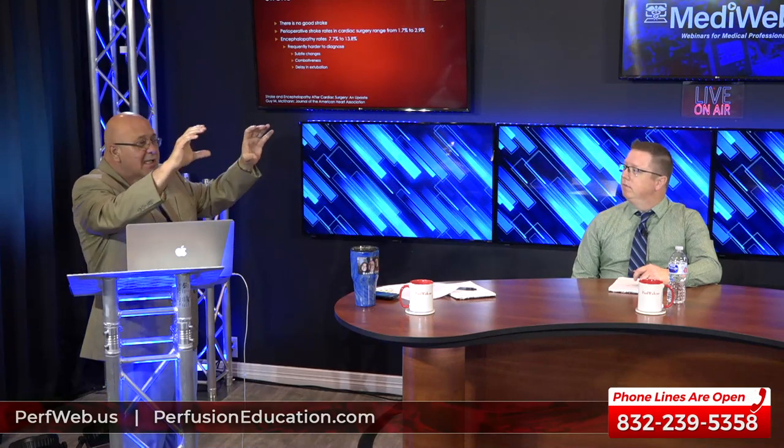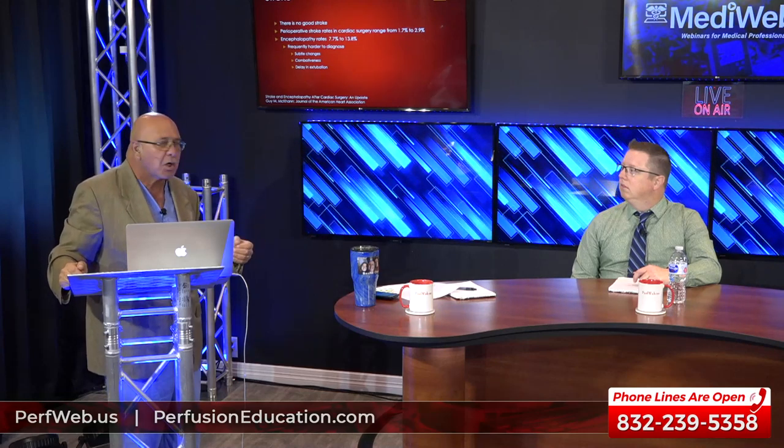It's not perfect. But if you make the decision to use it, and it's on the patient, and your numbers are reading, let's just say 60 and 60, and they pick the heart up to do the circumflex graft, and your cerebral oximeter reading on the left side goes to 25, that should raise an alarm. You should be saying something's wrong, okay?